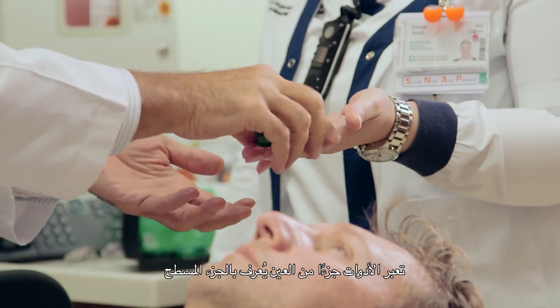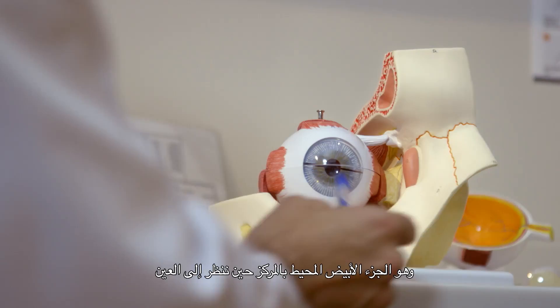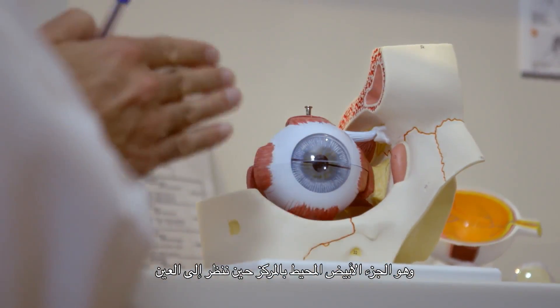The instruments go through a part of the eye that we call the pars plana, which is really the white area that surrounds the center that we look at in the eye.